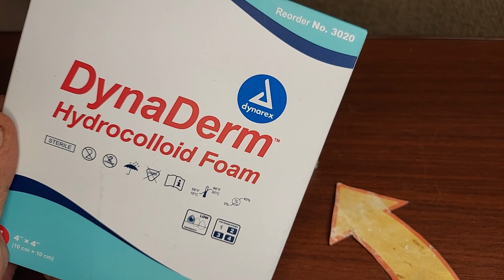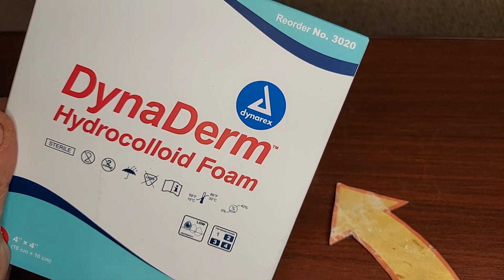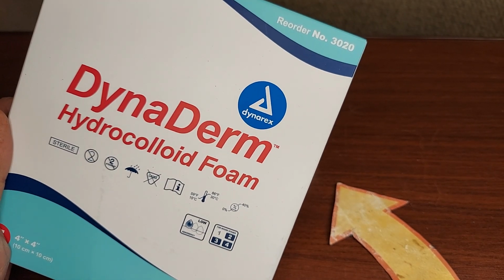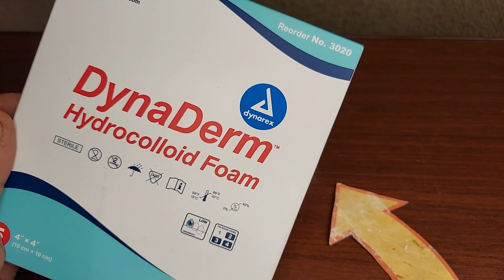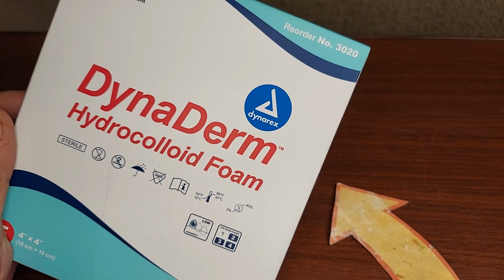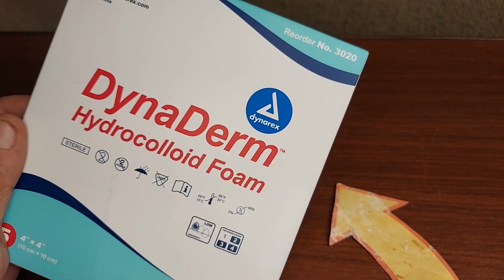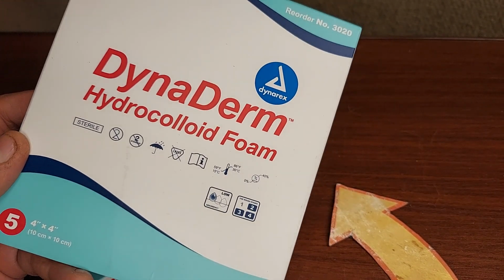If you have a mild wound that you need a dressing for, that you need to safeguard, like a burn or an abrasion or a laceration or a cut, you want to keep things out of that wound, but you also want to keep it moist and give it a good environment for healing. That's where these hydrocolloid foam bandages fit in.